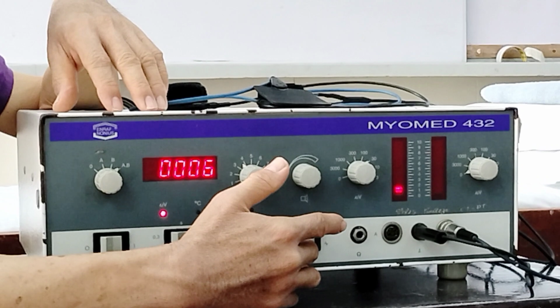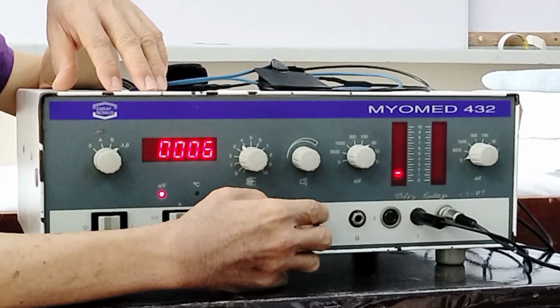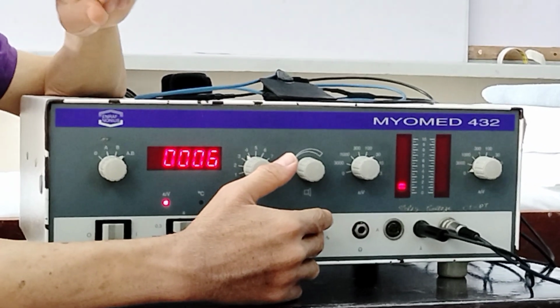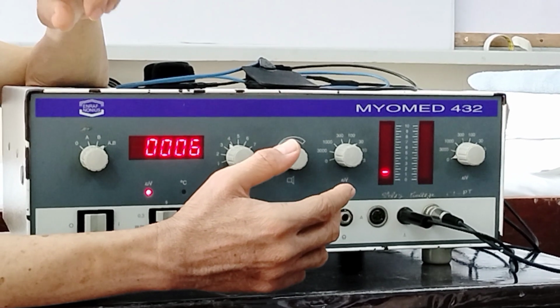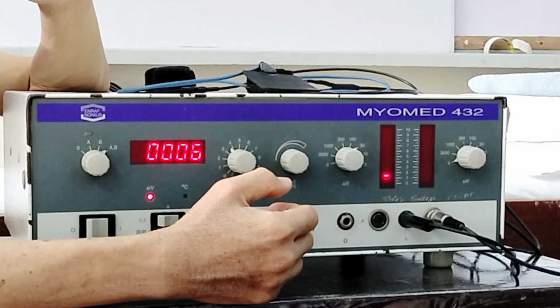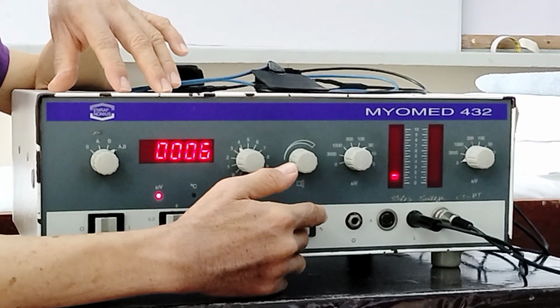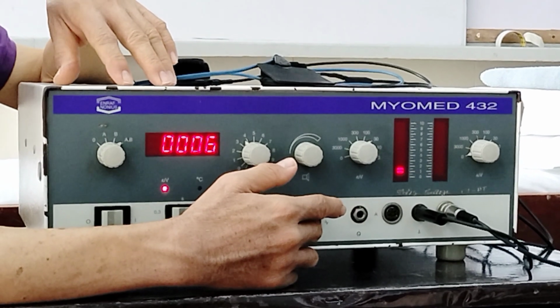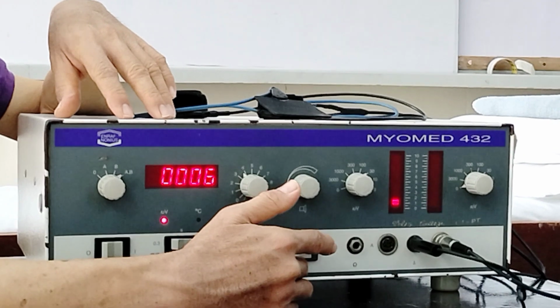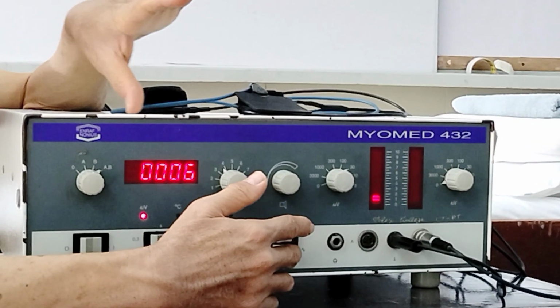As the patient contracts, the sound goes tap, tap, tap, and becomes faster. So that is what you expect with the rectified signal. The other one here on the right side is the unprocessed signal, which sounds like the blowing of wind.